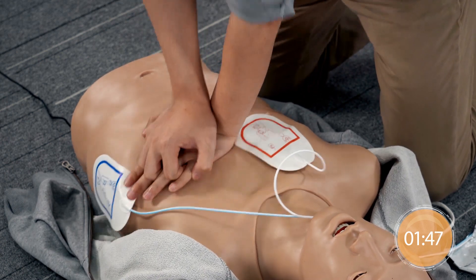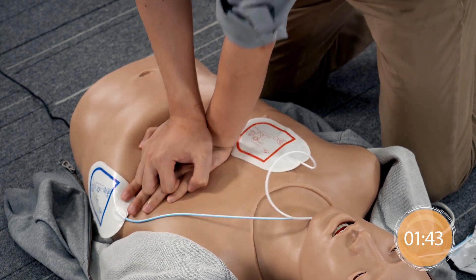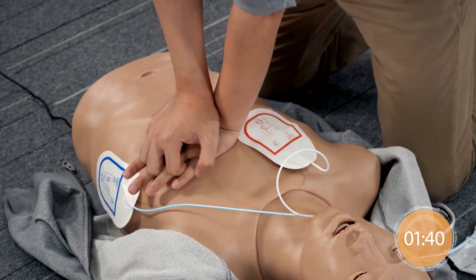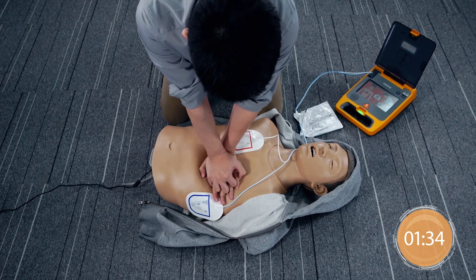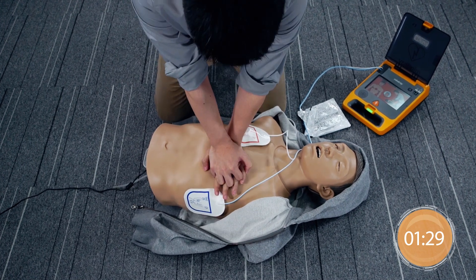Give chest compressions immediately. Continue to compress without rescue breaths. Place one hand on center of chest. The other hand should be on top of the first hand. Interlock the fingers.